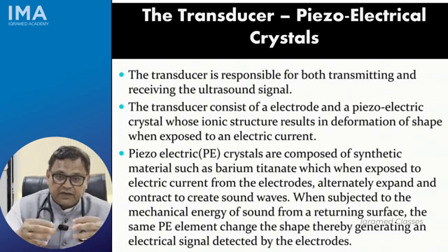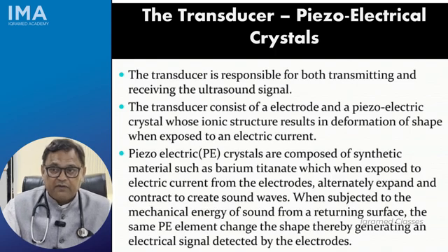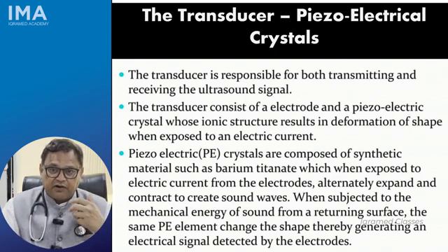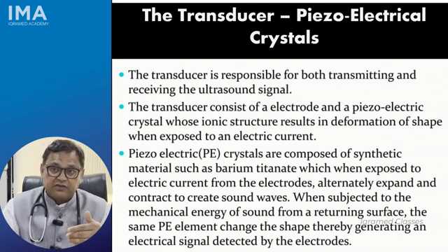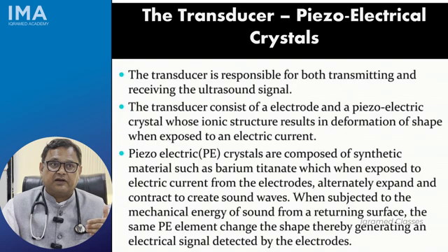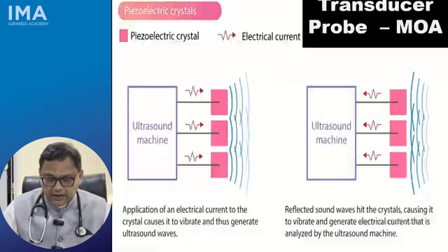So basically, the piezoelectric crystal is the main element of the probe, where electric energy gets converted into sound energy. Then once it strikes the structures and comes back, it is again collected, and goes to these piezoelectric crystals, which convert sound waves into electrical energy again, and this electrical energy goes back, and this happens.